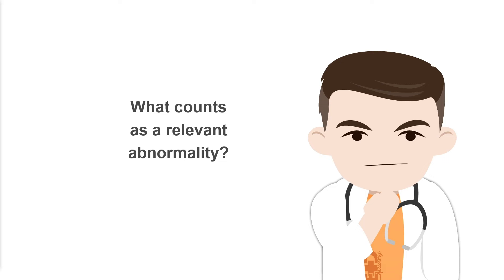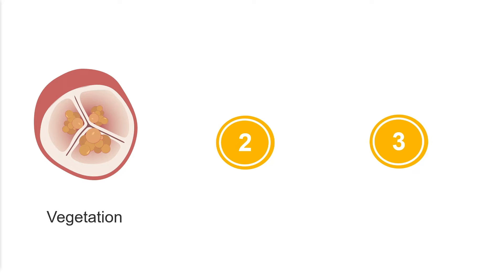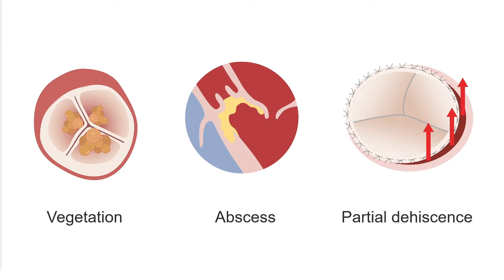There are three key echocardiography abnormalities to look for during an endocarditis study. Firstly, the presence of one or more vegetations. Secondly, the presence of a valve abscess. Thirdly, partial dehiscence of a prosthetic valve.